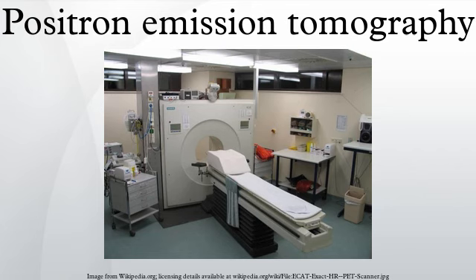Musculoskeletal imaging. PET has been shown to be a feasible technique for studying skeletal muscles during exercises like walking. One of the main advantages of using PET is that it can also provide muscle activation data about deeper-lying muscles such as the vastus intermedius and the gluteus minimus, as compared to other muscle studying techniques like electromyography, which can be used only on superficial muscles.